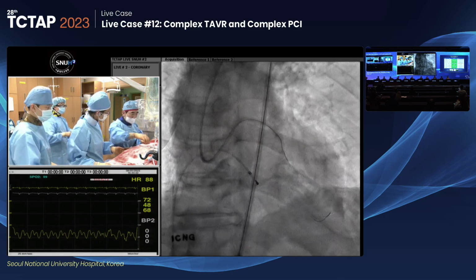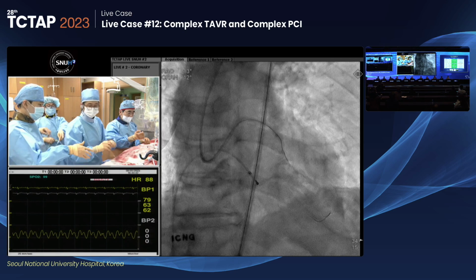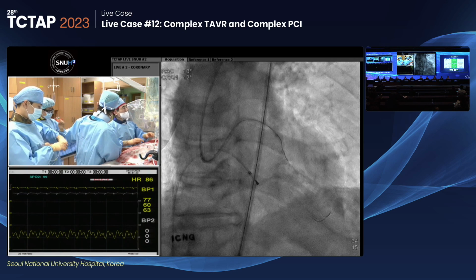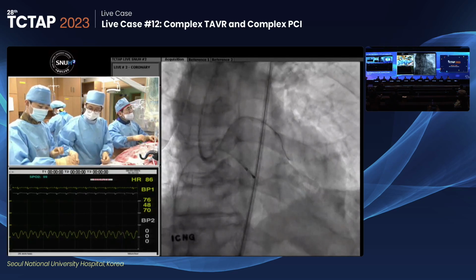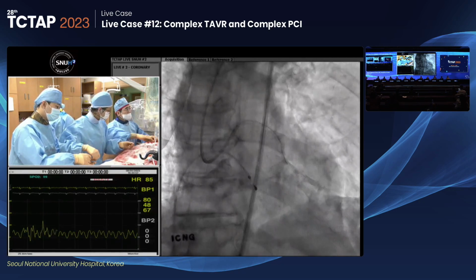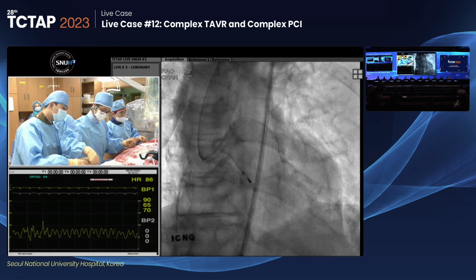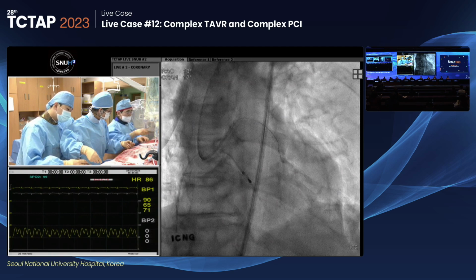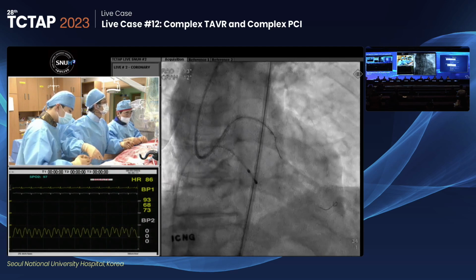Rota wire once again. Yes. Put some hydrophilic stuff on the rota wire. After this last rota wire, we're going to finish this live. Yes, we move to another. It has to be a new rota wire. Well wet. And you have to pray a little bit also. Easy.